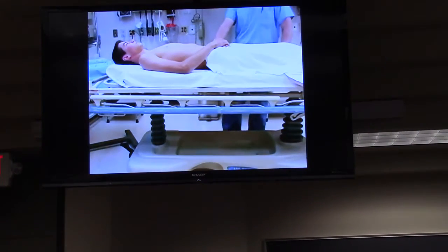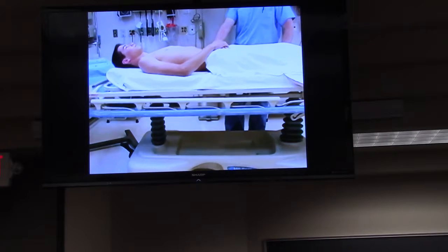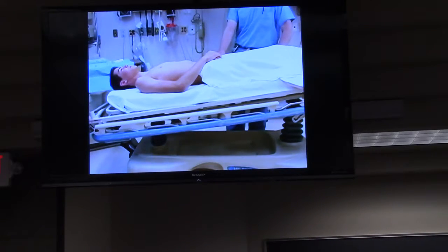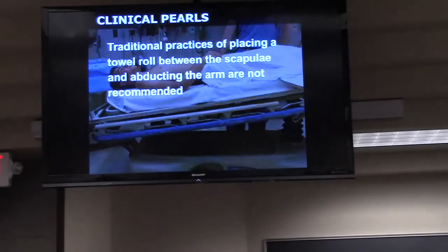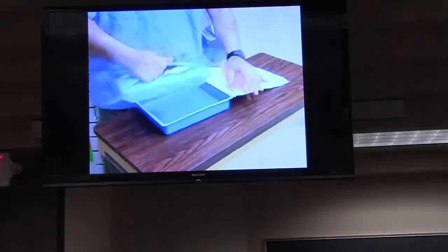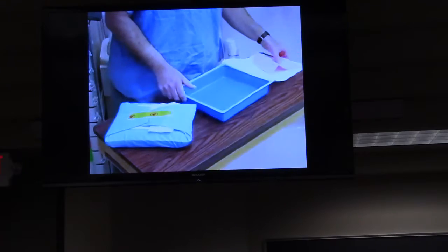Position the patient supine with the stretcher placed in 15 to 30 degrees of Trendelenburg. The bed should be at a sufficient height that you do not have to bend over or stretch during the procedure. Traditional practices of placing a towel roll between the scapulae and abducting the arm are not recommended. Open the central line kit on a bedside table positioned within easy reach.